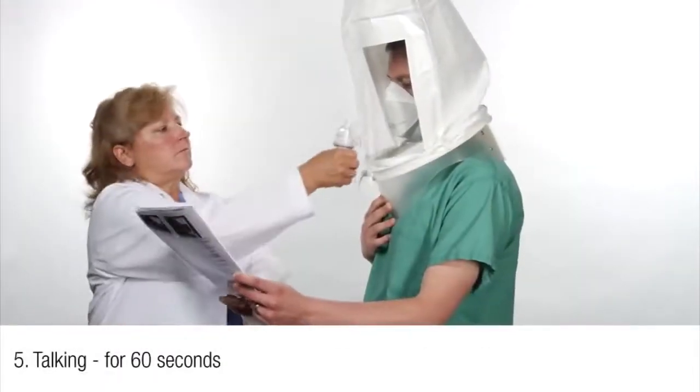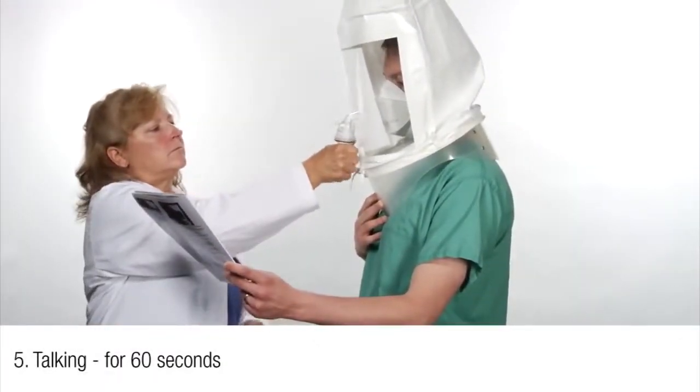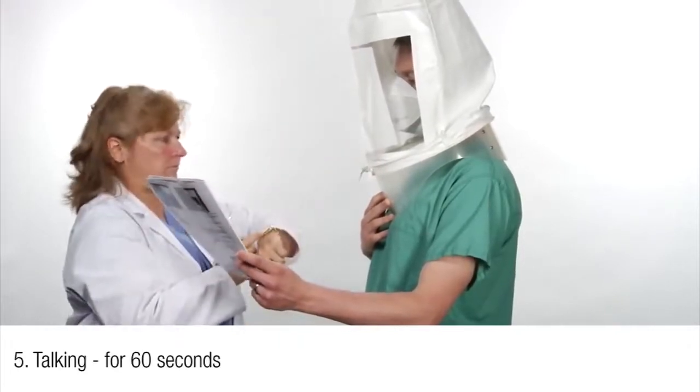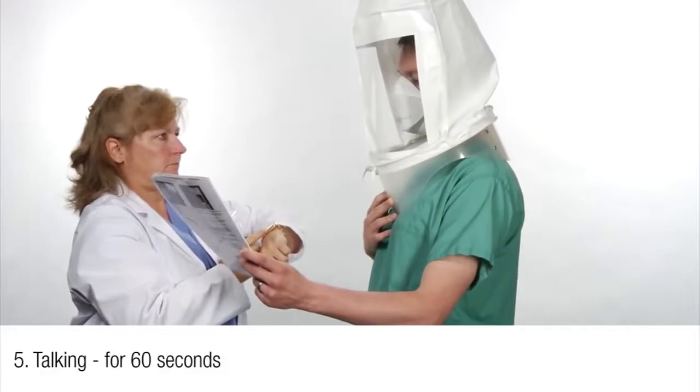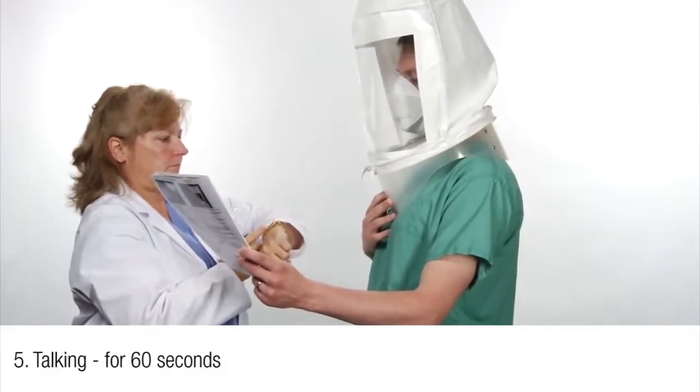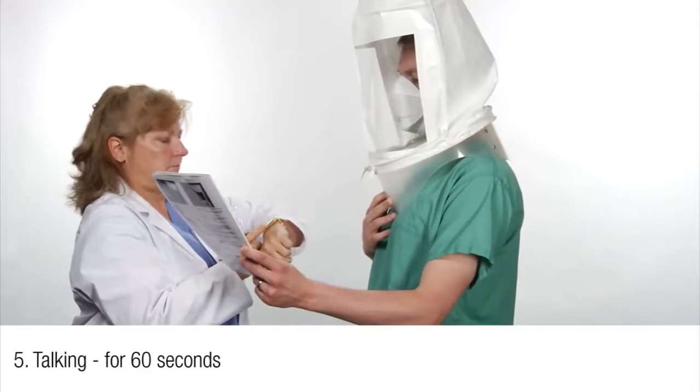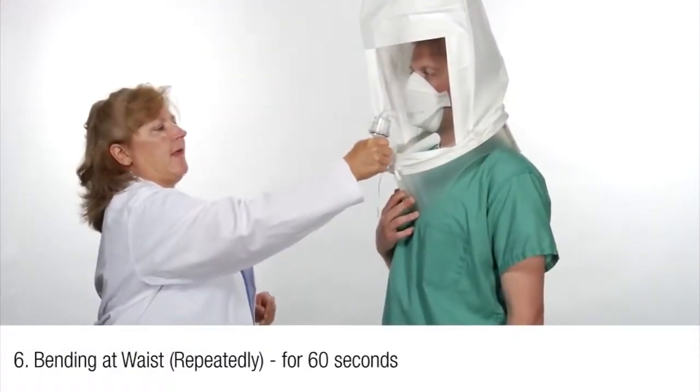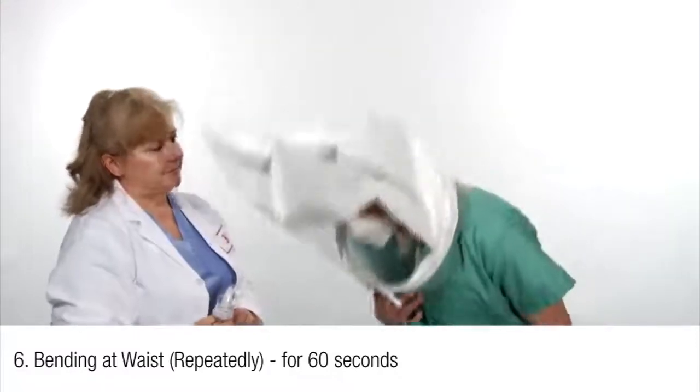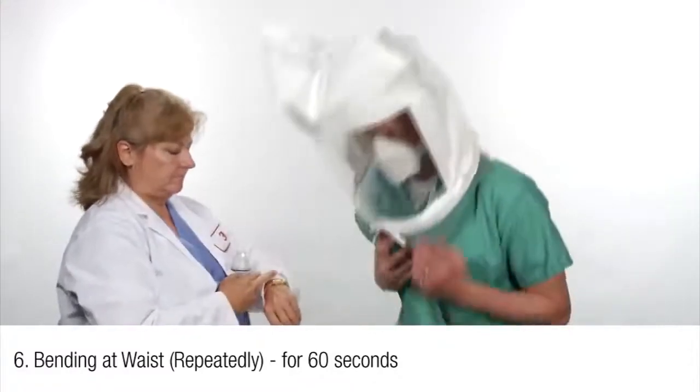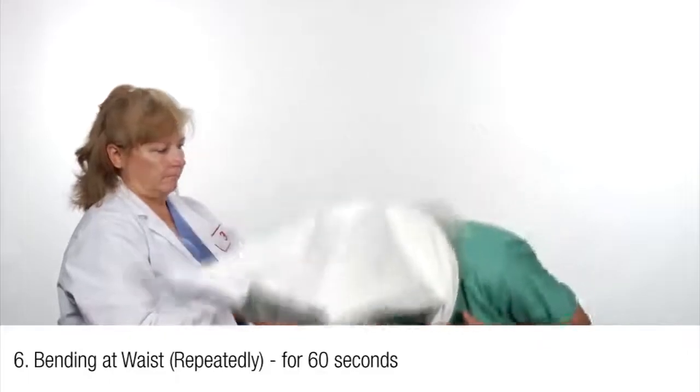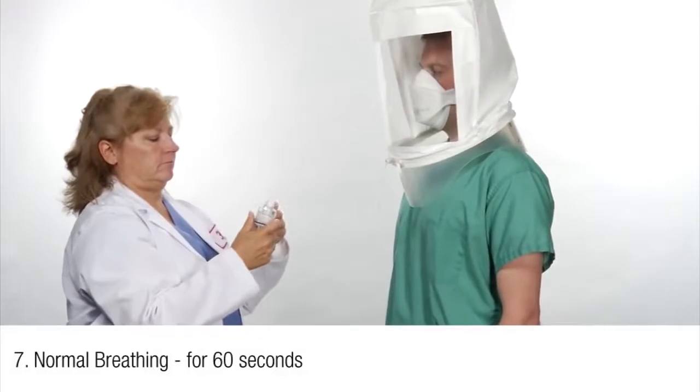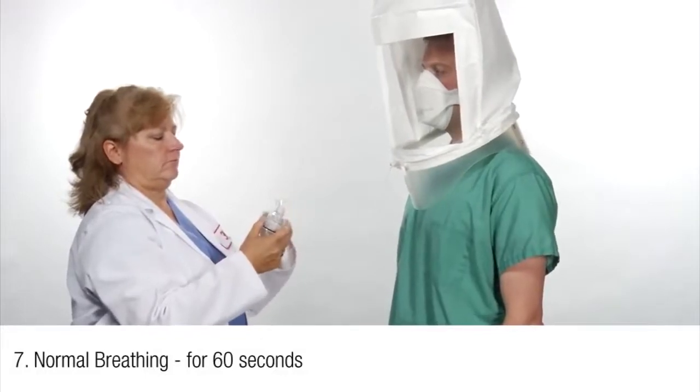Fifth, the subject shall talk out loud slowly and loud enough so as to be heard clearly by the test conductor for 60 seconds. A reading called the rainbow passage is included in the print instructions for the 3M qualitative fit test. Sixth, have the subject bend over at the waist as if he or she were to touch their toes for 60 seconds. Jogging in place may be substituted for this exercise. Conclude by asking the subject to breathe through their mouth normally again for 60 seconds.